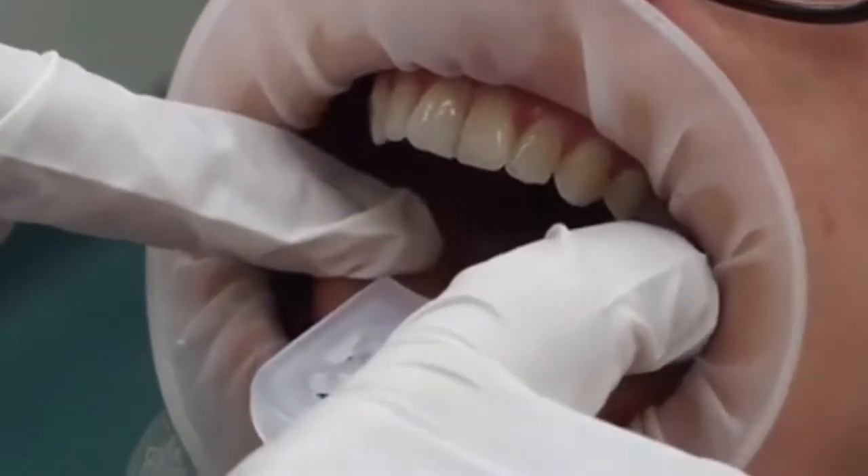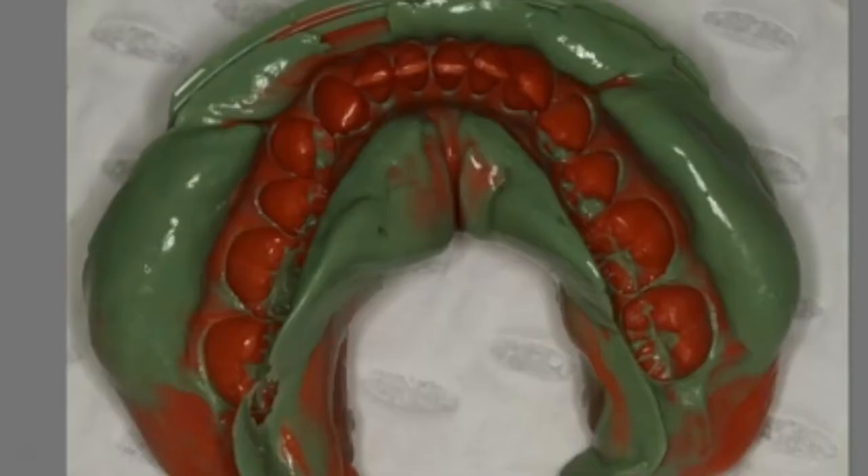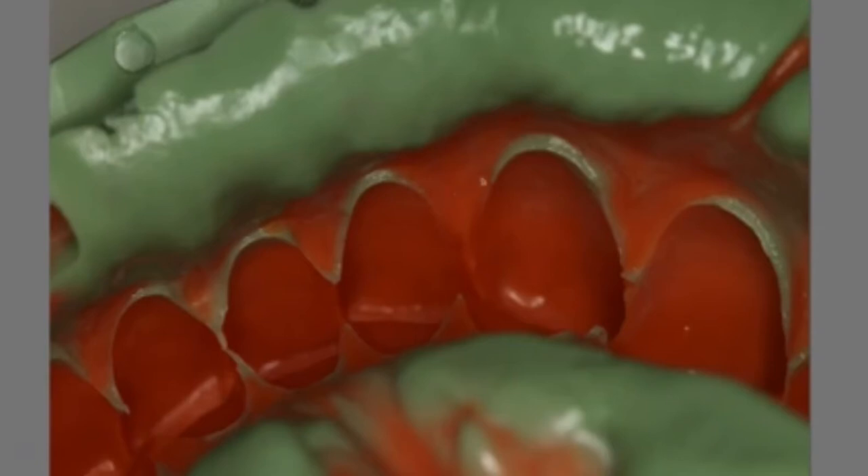The tray is pressed down — because it's non-perforated it takes a fair bit of pressure — and you can see here the amazing detail. The pressure, the dryness, and the lack of bubbles has allowed the silicone to get very crisply into the gingival margins. There's a little bubble on the flange but that doesn't concern us for this type of impression. Even on the distal of the molars we've got crisp margins, there's no burn-through on the front part of the tray, and the tray is not touching the teeth. For a technician to wax around these margins would be incredibly easy because it's so clear exactly where they are, and your temporaries would fit so much better.